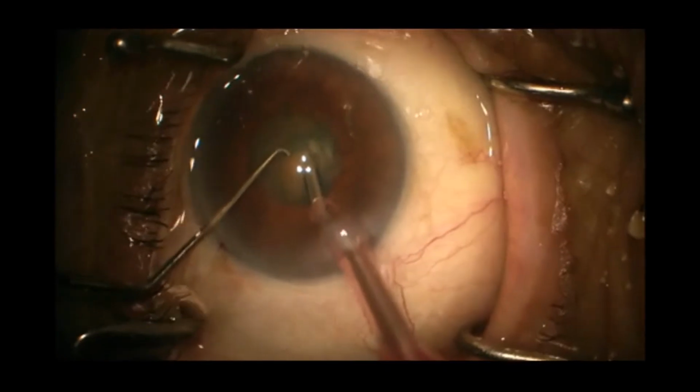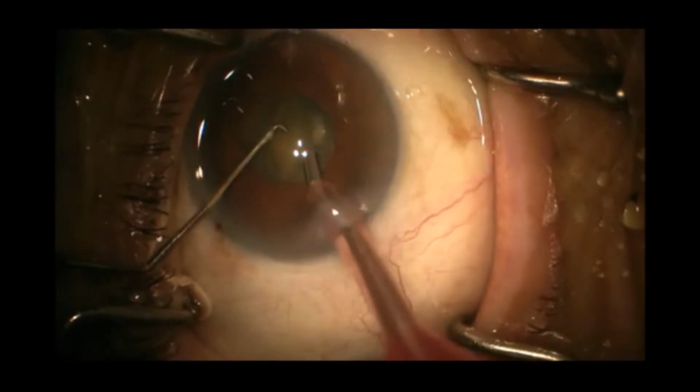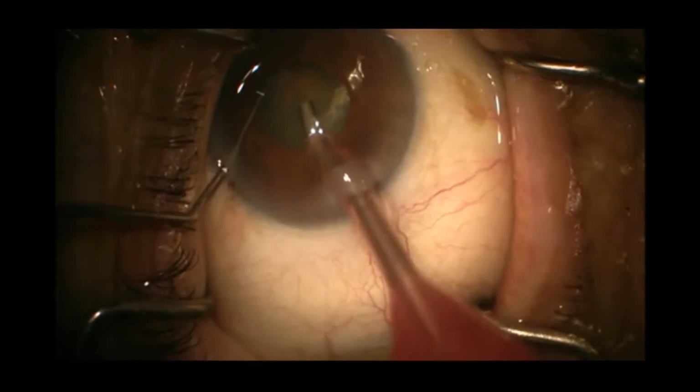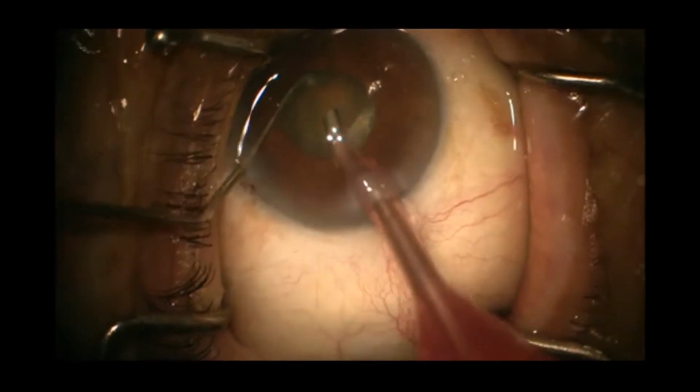Now I start with phacoemulsification. This is a Centurion Vision System. I make a small central sculpt and then go for a direct chop. So this small central sculpt gives me adequate space so that I can bury my phaco tip down into the center of the nucleus.